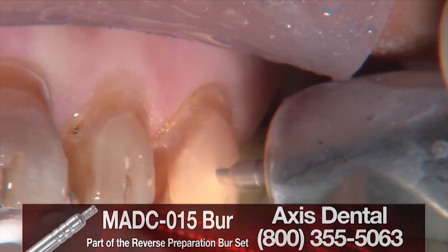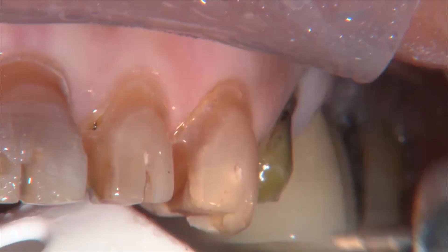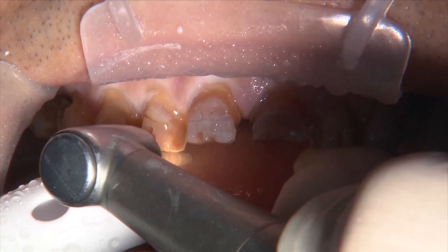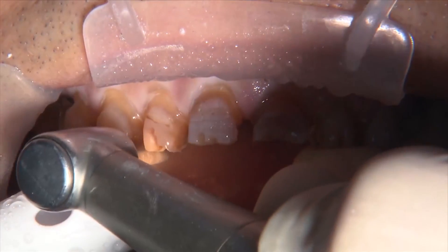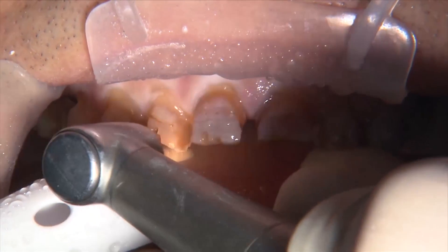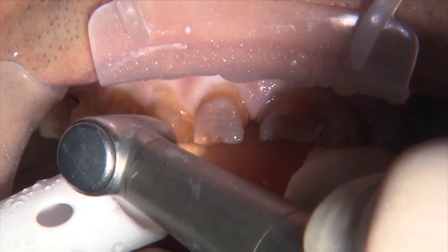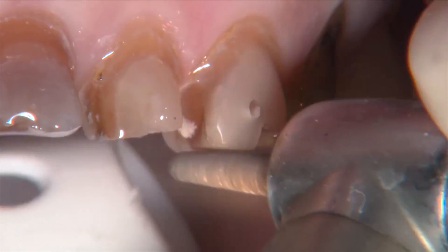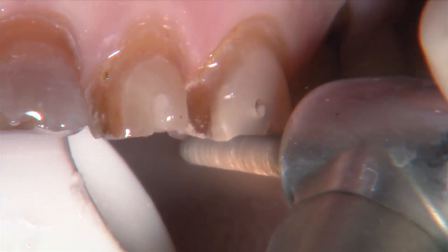I'm placing my incisal depth cuts, doing it a little slower than I usually would because I'm watching for the color change in the tooth structure — just to kind of see it happen, I'm fascinated by it. Now the axial depth cut being placed at the junction of the incisal third and the middle third with the incisal edge depth cut. We've got our margins already prepped, highlighted in red and fuchsia, the incisal depth cuts in green, and the axial depth cut in blue. Now we take that 856-025 bur and just fly through these teeth, reducing until we can't see these depth cuts.